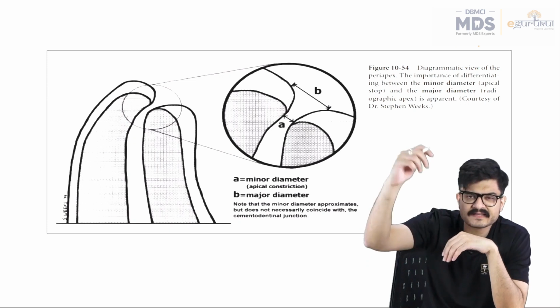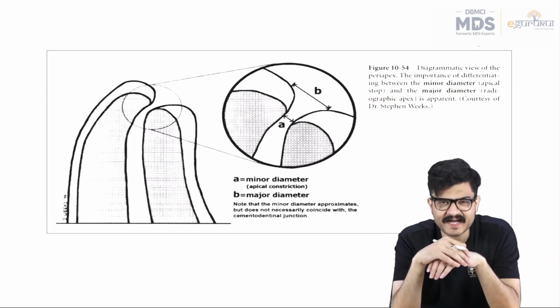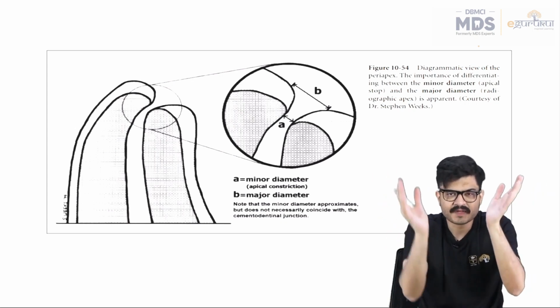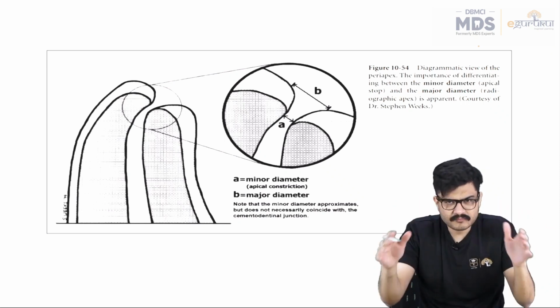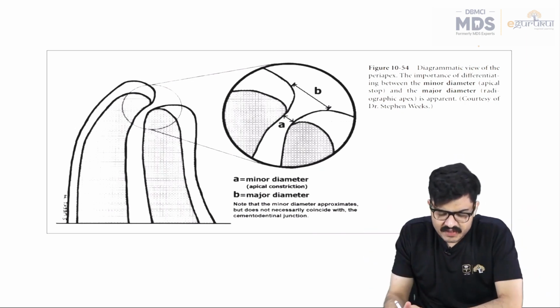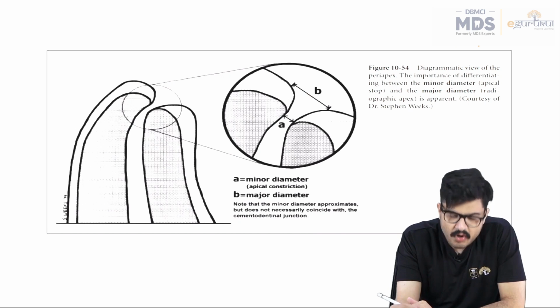The sun rising from in between the two inclines of the mountain, right? This appearance looks like half the rising sun in between the mountains that we used to draw. So that is why this shape is also known as the morning glory.